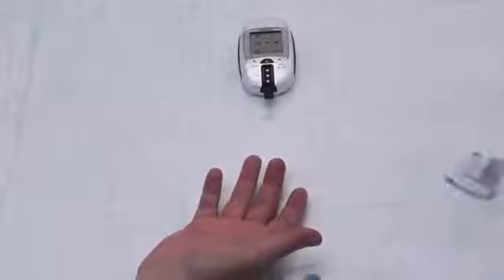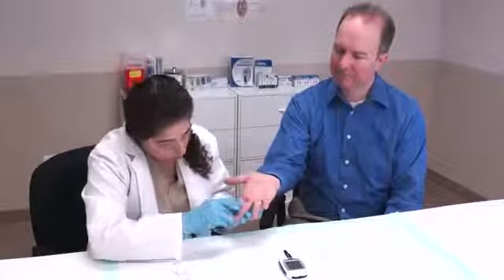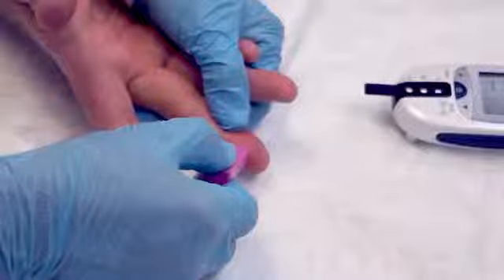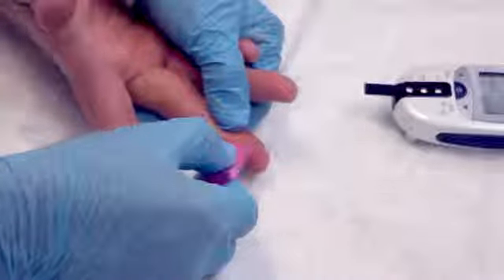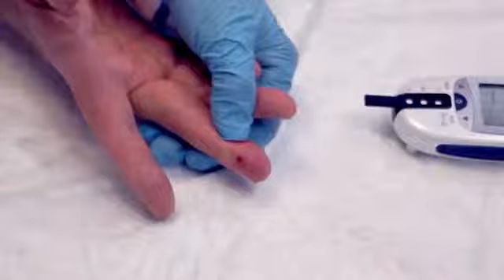Clean the area to be lanced with an alcohol swab. Allow the skin to dry for 30 seconds or wipe dry with a gauze pad. Place the disposable lancet lateral, just off center of the finger pad, and firmly push to make a deep puncture. The finger should be pointed in a slightly downward position.